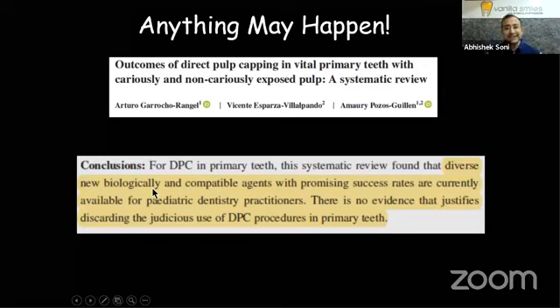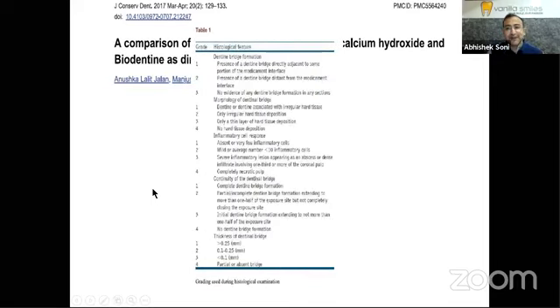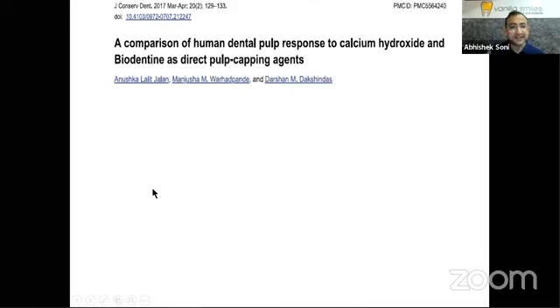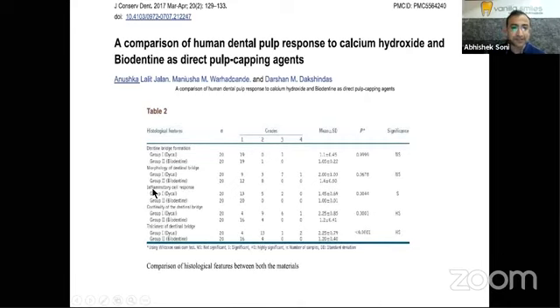So now there is enough evidence that we put a stop on invasive pulpal procedures. And that is only because of the presence of bioceramics that are available in our practices. That includes your Biodentine and your MTA. So let's look at the role of Biodentine in this specific study, where they talk about the inflammatory cell response. If you see, the inflammatory cell response was grade 1 for all the 20 teeth treated with bioceramics. And that's because this is a purified product.